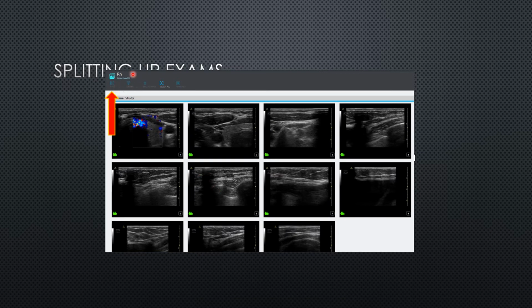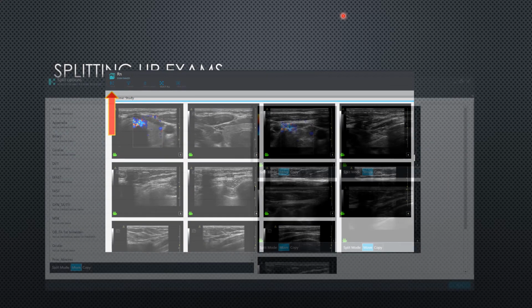Also, if you want to export the studies because you want to give a presentation or something on it, this is where you would do that as well. If you have none of the images selected, it will export them all by default, I think, or you might just have to hit select all, or just whichever one specifically you want to export, and then it'll export it in a zip file. But this is where you would do that as well.